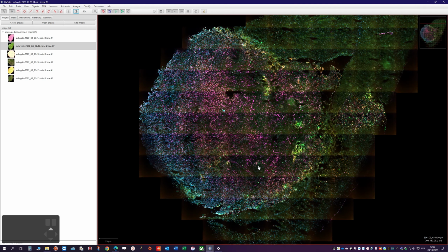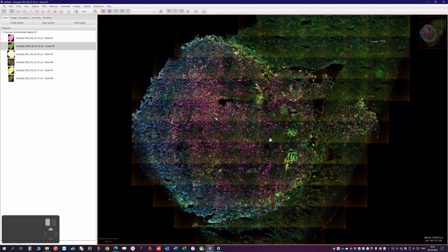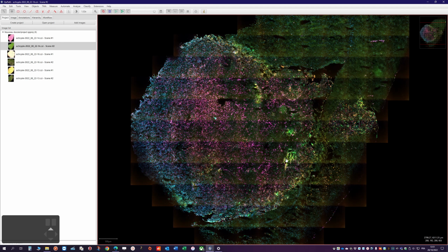So the main point of this topic is not the multiplexed analysis, since I've already done a video on that, but how to proceed to create a nice and unbiased training image. So usually what you want to do is try to get any human input out of the picture if possible.